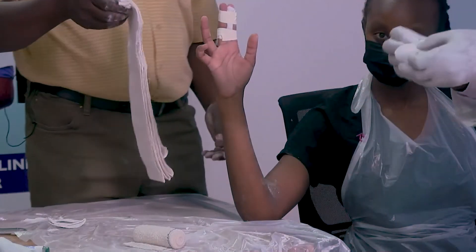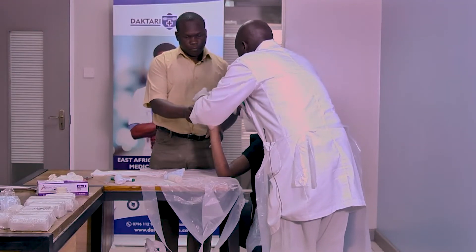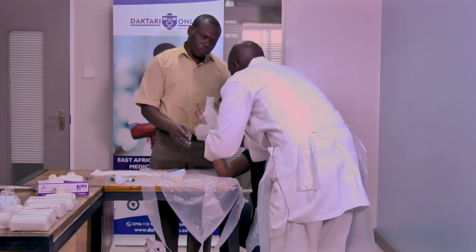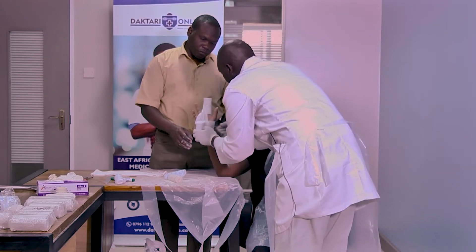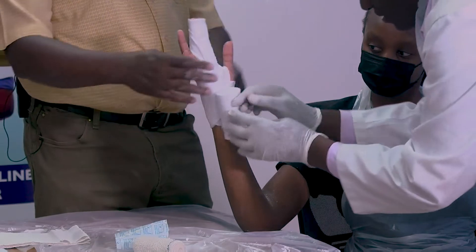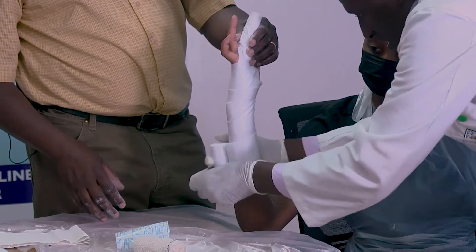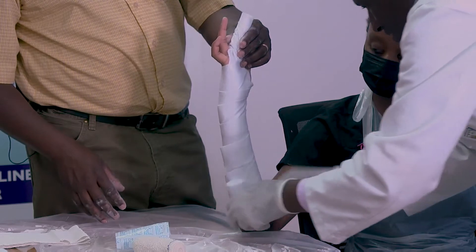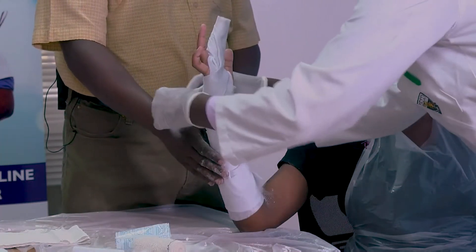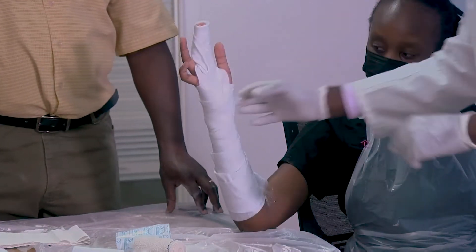From there we have our soft band — padding it. We are padding it, ensuring 50% overlap. Then come again in between the thumb, then go proximal. Not too tight, not too loose — remembering 50% overlap. The other prominent areas are very important when doing any application. We have added some soft band at the wrist.